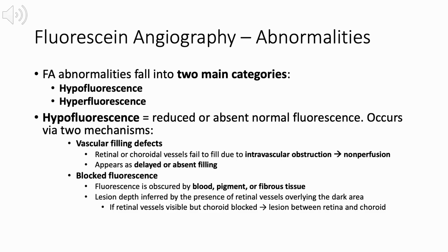The first is a vascular filling defect, in which retinal or choroidal vessels fail to fill due to intravascular obstruction, resulting in non-perfusion. This appears angiographically as delayed or absent filling of the affected vascular territory.